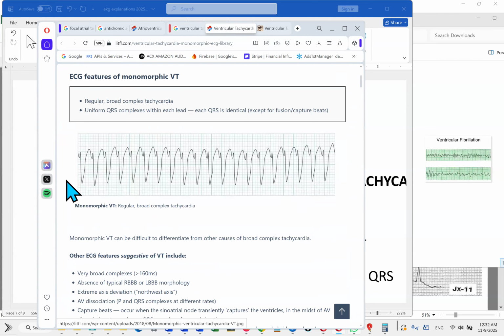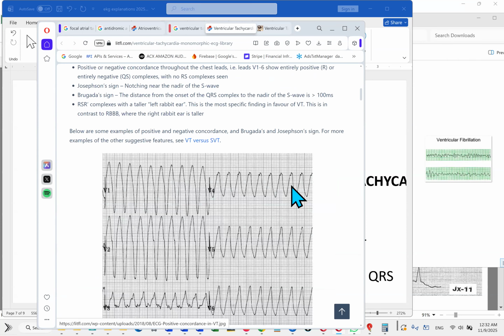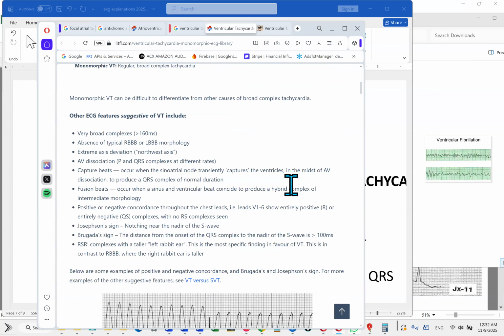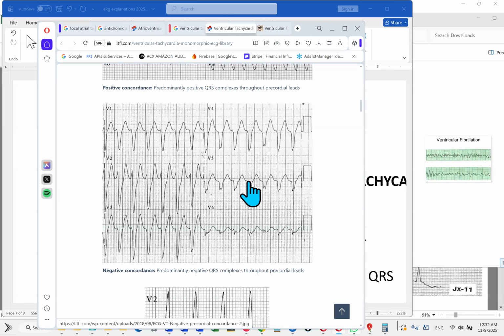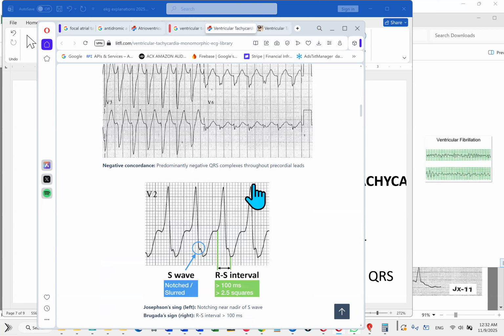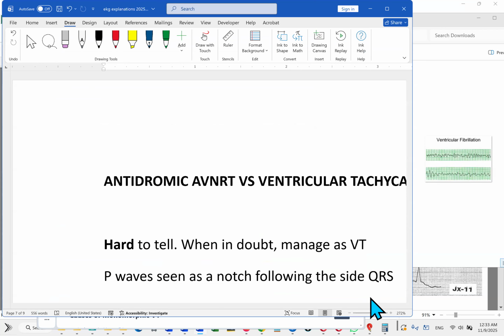But this one is kind of blatantly ventricular tachycardia because it's such a huge, wide complex, plus everything is exactly the same height. So that's the other point to differentiate monomorphic versus polymorphic ventricular tachycardia. In polymorphic, the amplitude keeps changing. In monomorphic, the amplitude is the same. See, this is another case of ventricular tachycardia. It's really hard to tell. But you can't say this is ventricular flutter. Flutter is different; we're coming to flutter in a second. Flutter is a completely different thing.